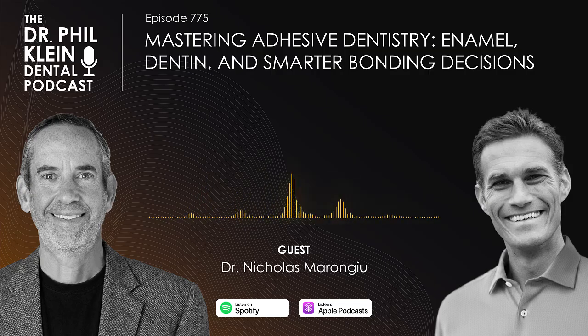And there's one step that we will take, if there's a deeper restoration where you have any concern about the depth of the cure. With the Scotchbond Universal Plus adhesive, if you scrub it on the tooth and go through the process there, light cure that before delivering the restoration, if it's an indirect restoration. Light cure that first, because it primes that surface and then that will interact with the Relyx Universal to be able to kick off that dual cure to ensure that full cure depth. And that's one of the other little steps that you can do.